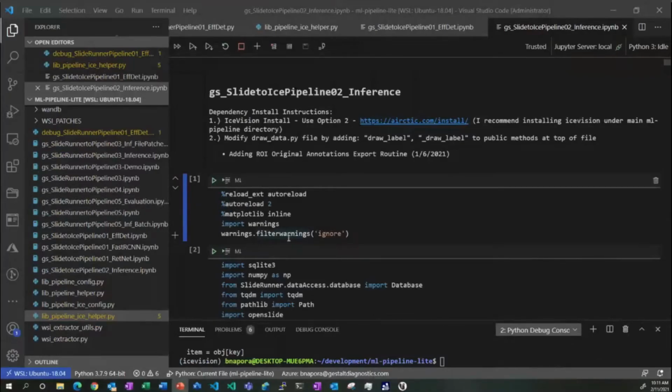So if you have boxes that are less than 32 by 32, they're considered as small, then your average will be a lot lower. And this is maybe what explains that in some cases some boxes will not be detected, you see.